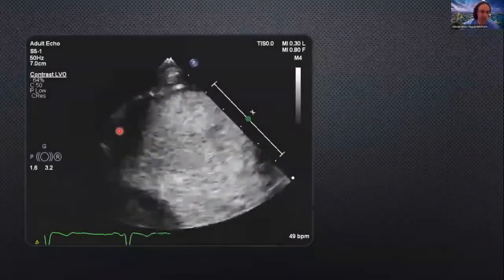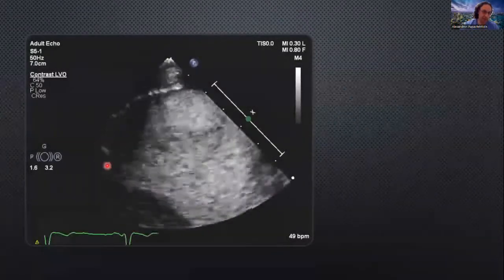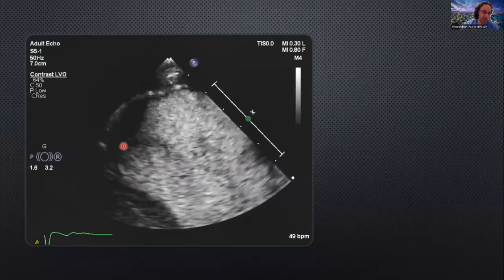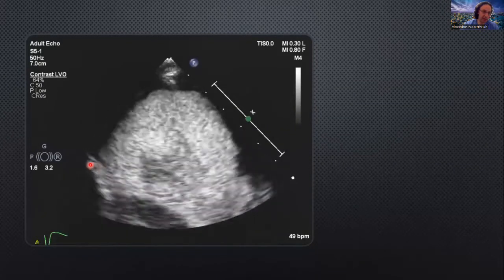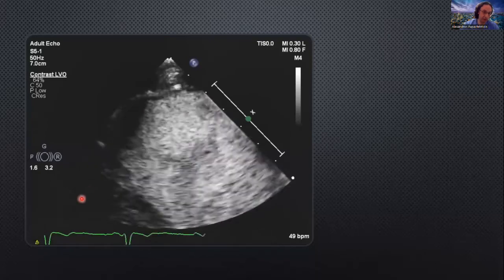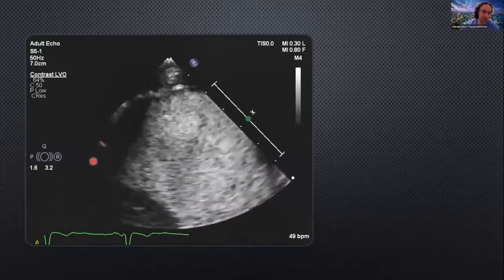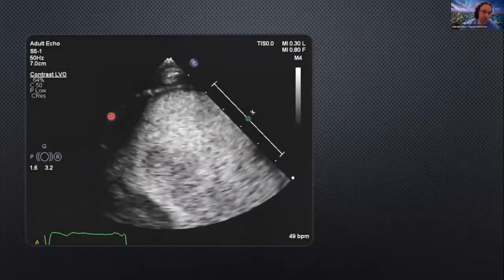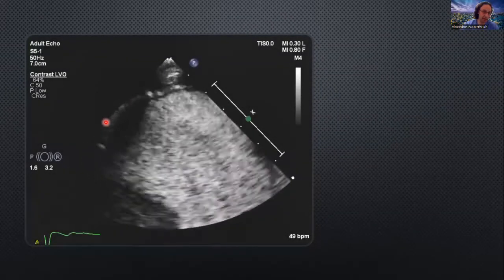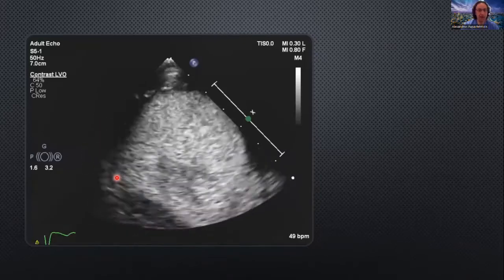And I don't think it is because you see the dark area does not go through the myocardial wall, so it stops there. And actually, you can see the scar here, this bright area is a scar. If it was shadowing, it should go through the myocardium, because the scar would be shadowed. So I think it's just a filling defect, and the myocardium is over there, there's the white area here, there's a scar, and it continues over there.